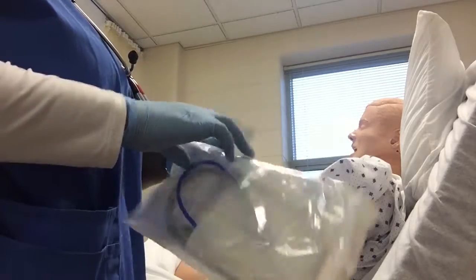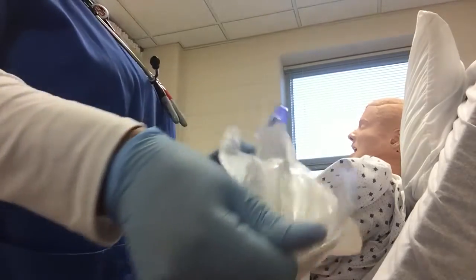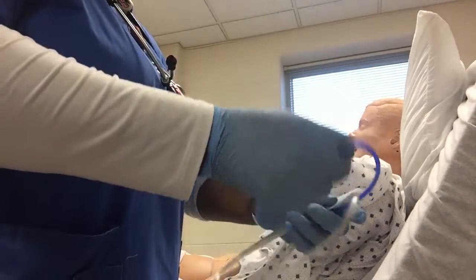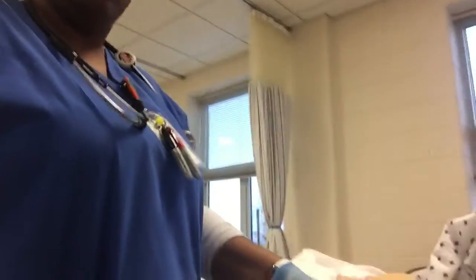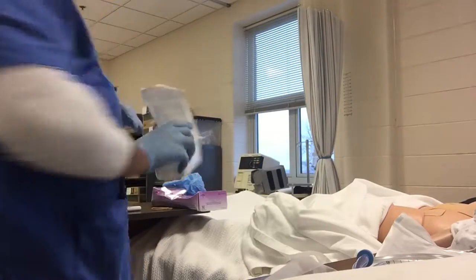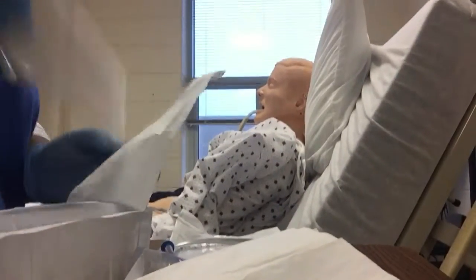Get my NG tube. Get a towel, place it with the patient.